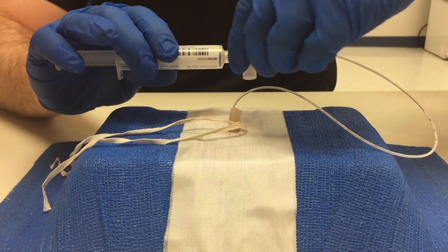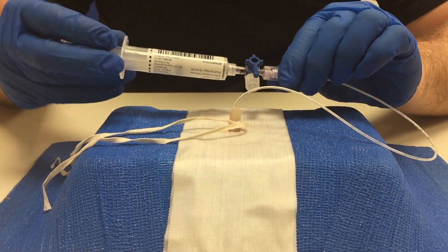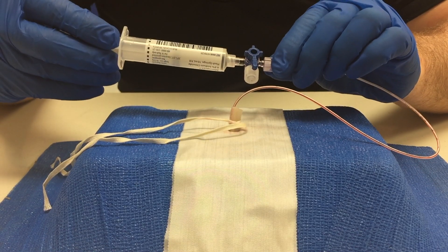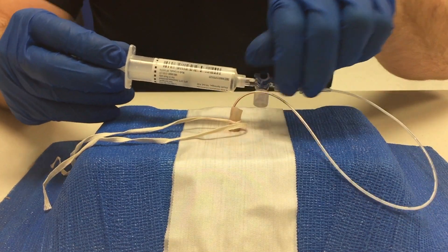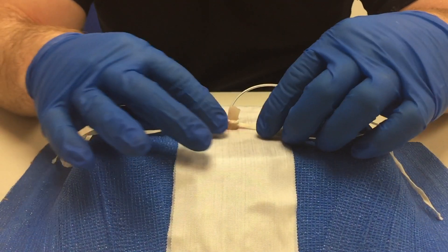To confirm proper placement, you must now turn the stopcock on to the patient, withdraw a small amount of blood, and then infuse 0.5 to one milliliter of saline. Also remember to turn the stopcock off to the patient when not in use.